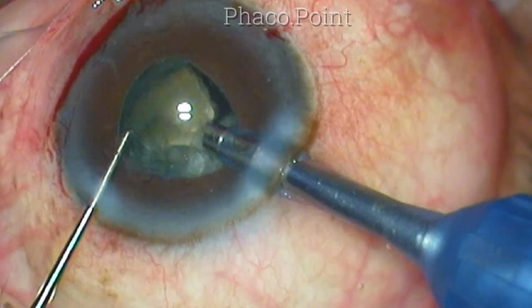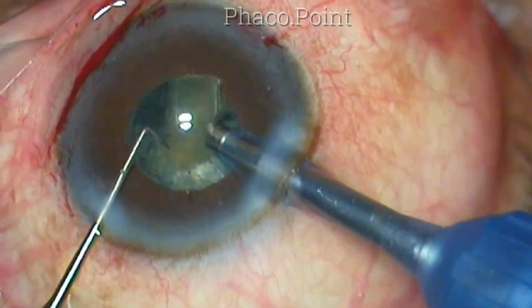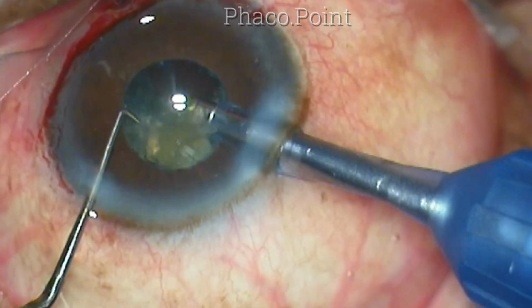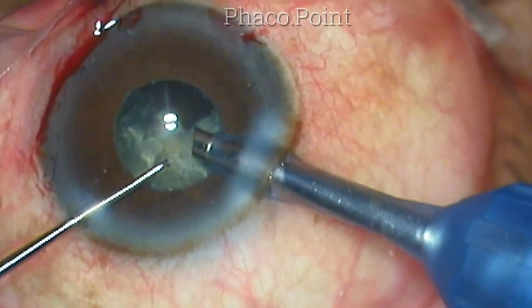While creating the small rotatory movement of the phaco needle or the phaco tip, make sure that you face the bevel always towards the fragment. This will also greatly improve the followability of the nuclear fragments.